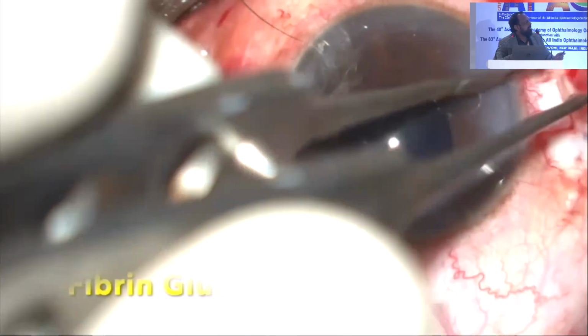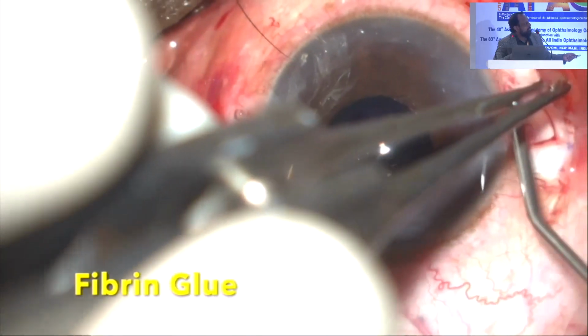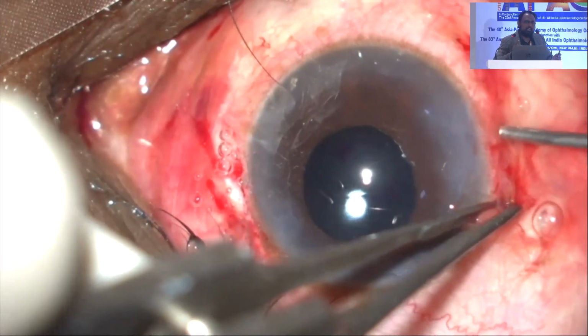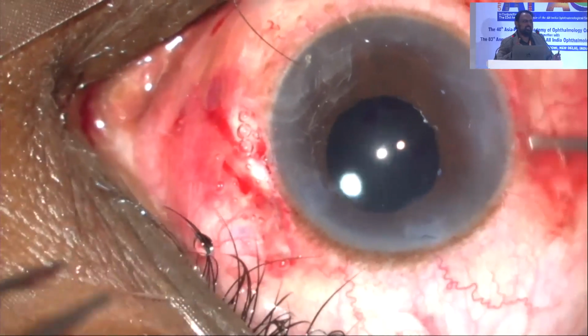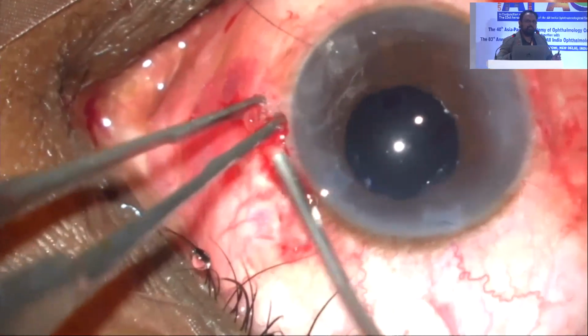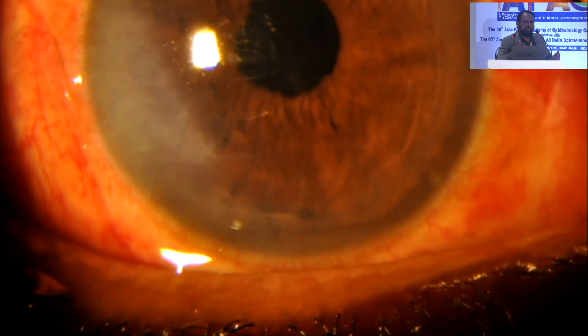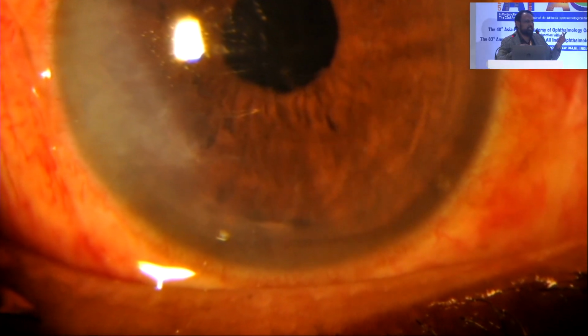Initially we were gluing the flaps and using sutures. You can either glue it, use your suture, or even just cauterize it, because here these haptics are slightly thicker. They are not the 3-piece lens haptics where you might have leakage because you're using a 23 gauge sclerostomy. You don't actually have to glue it, because the size of these haptics fits the 23 gauge sclerostomy perfectly. So there's not going to be any leak.